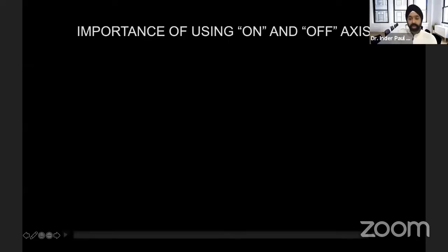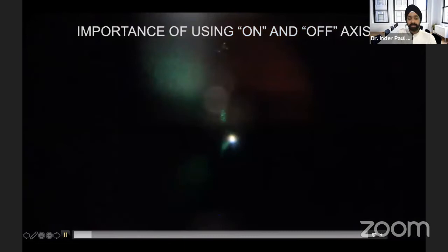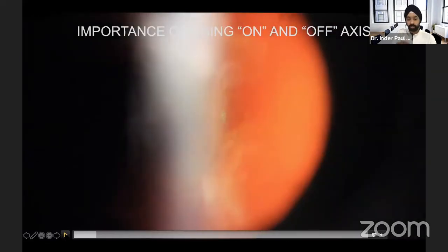Okay. And the reason I brought that up is because here's an example of a phakic patient with a large cloud behind the lens. Now, the patient went for a vitrectomy consult. The vitreous retinal surgeon said, I'm not going to do the procedure on you because it's too close to the lens and I'm going to cause a cataract very quickly. So he came to me. So I was afraid of the same thing.